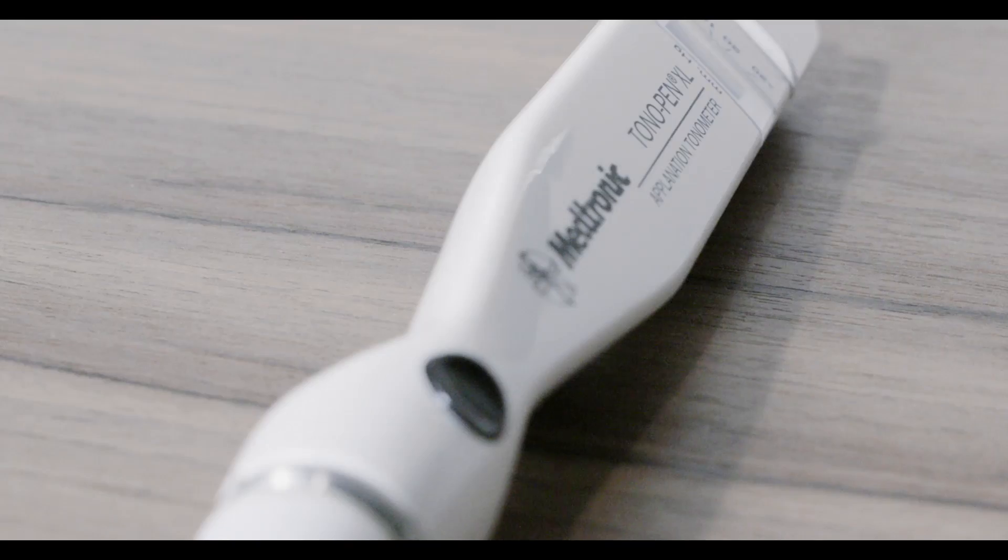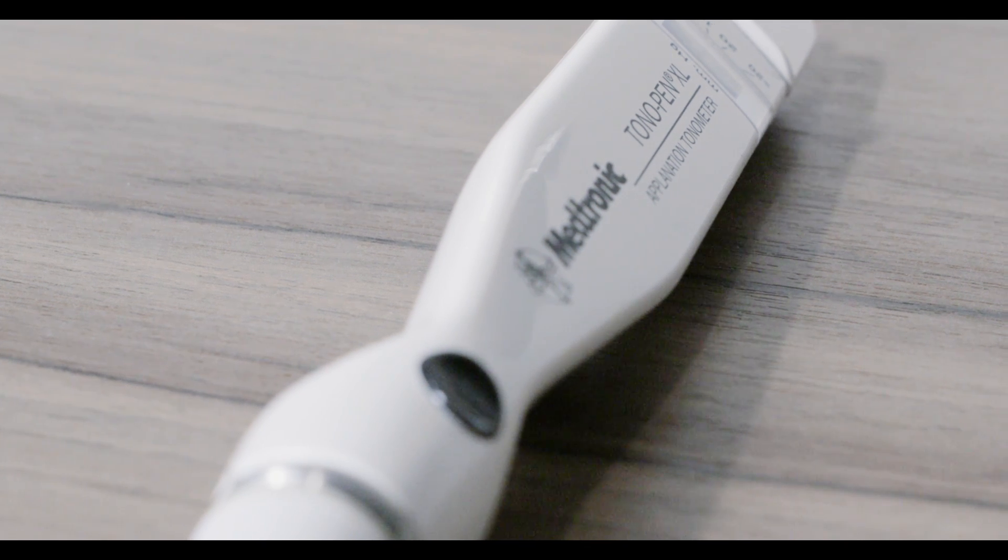Here we'll introduce you to the basics on how to use the Tonopan to measure intraocular pressure.